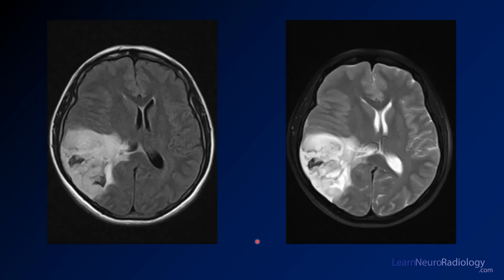On MRI, you have a FLAIR hyperintense mass involving much of that same area, with pretty well-defined margins. There are central areas of low FLAIR signal that are very dark. On T2-weighted imaging, this just highlights that dark area, and those correspond to the areas of calcification seen on CT.